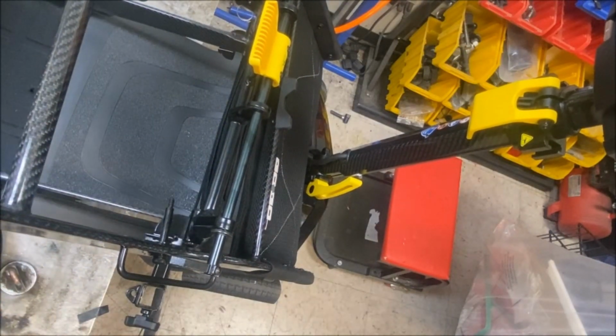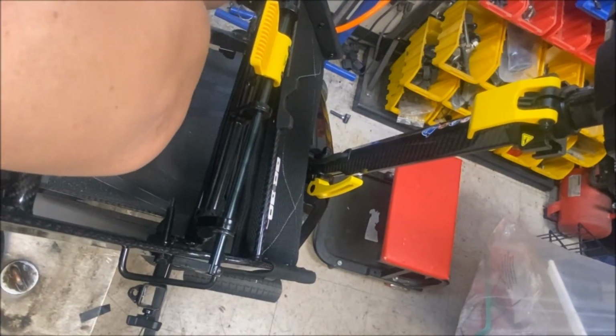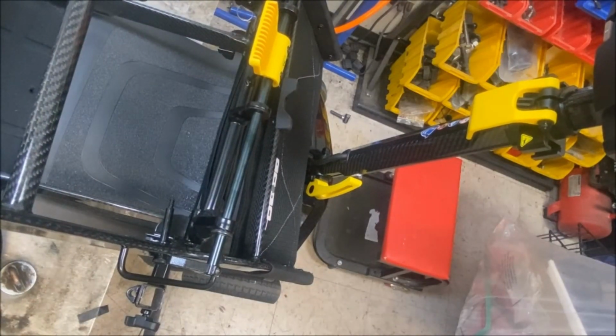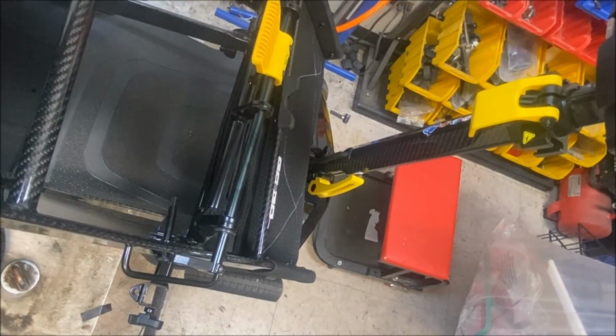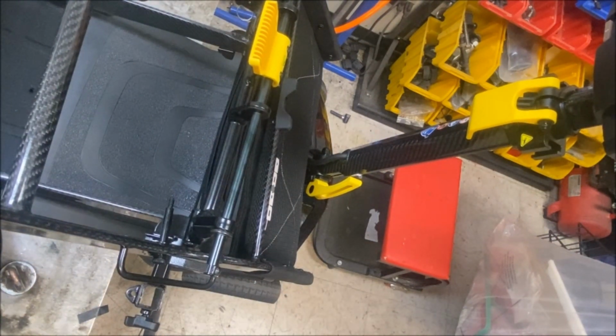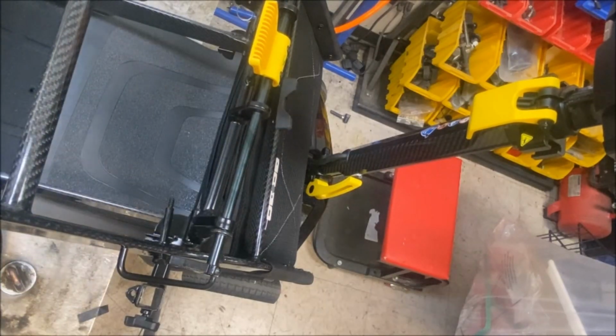Okay, so this should be one there. Yep, there's one on there already. So that's that one. And there should be two inserts there. One, two, one, two, one, two. That's that. Okay, let's get this back together.